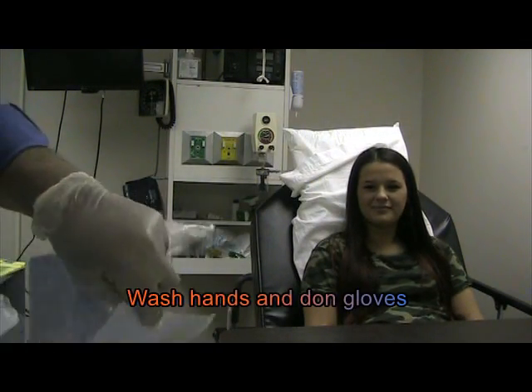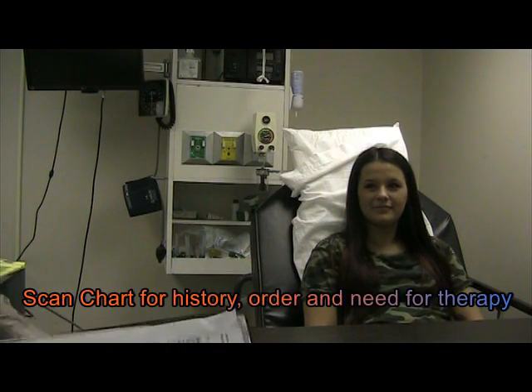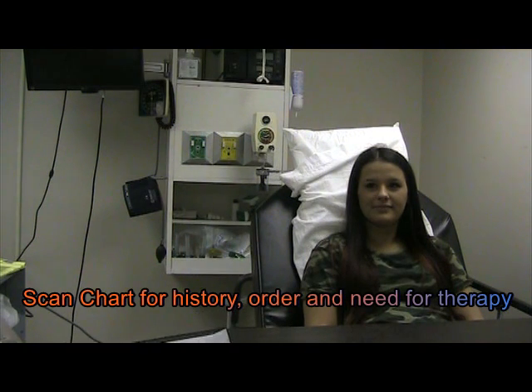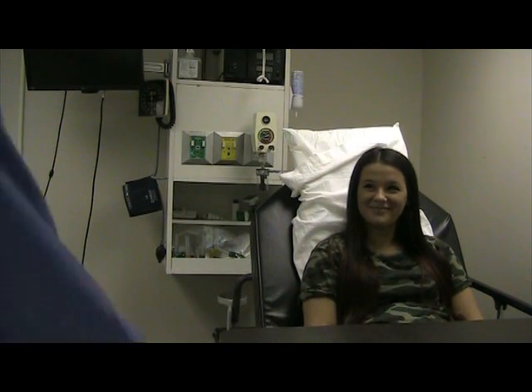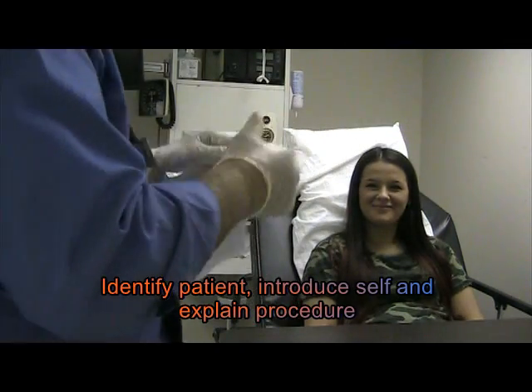Check the chart and we see that Miss Allie needs to have an inspiratory trainer. She is just not breathing deep enough. Got my gloves on, washed my hands.